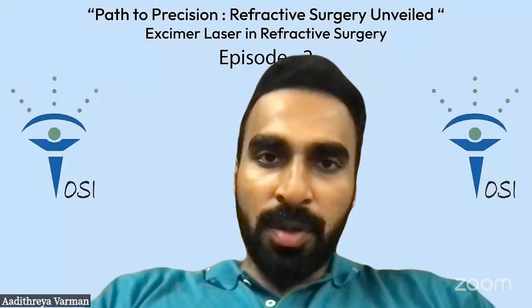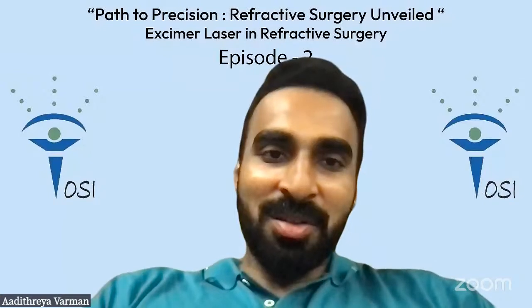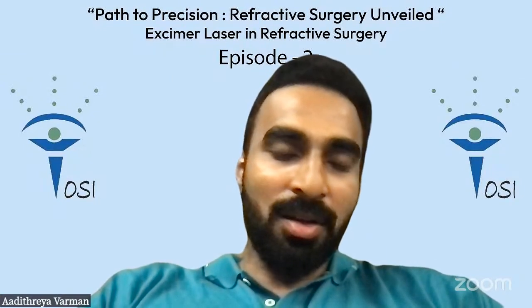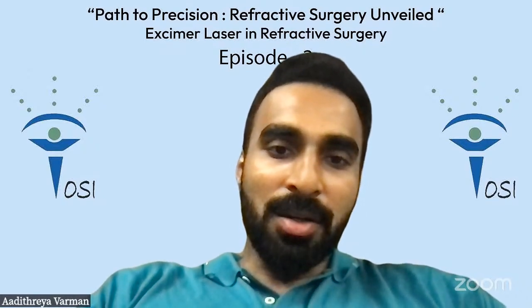The other thing is, ma'am, when I'm doing SMILE and I have a patient with a little tougher dissection, I'm actually happy on the inside because I know that it will not develop ectasia. Yeah, exactly. I feel the collagen is stiffer, so there's probably a lesser chance of ectasia. Whereas if I start dissecting and it's moving as smooth as butter, then I start getting nervous. You're absolutely right. A tougher dissection means you are at ease that ectasia probably won't develop. But with a smoother dissection, you don't know whether to do an extra procedure or not.